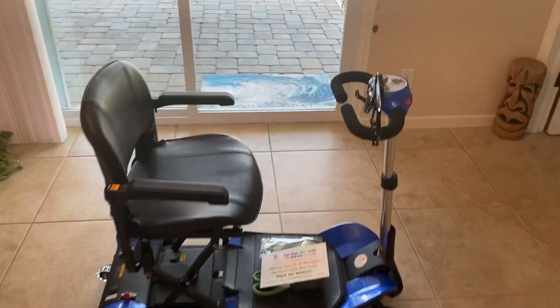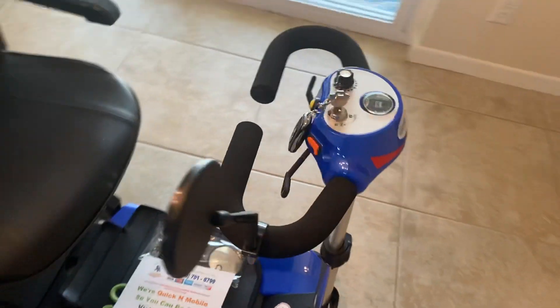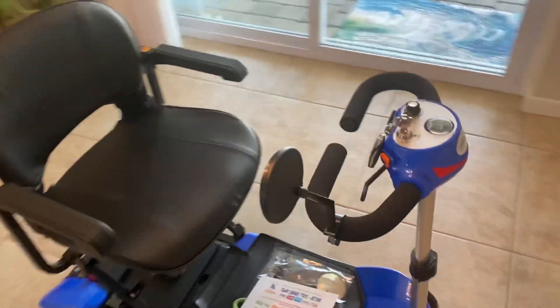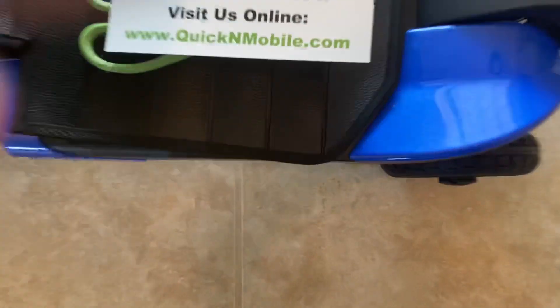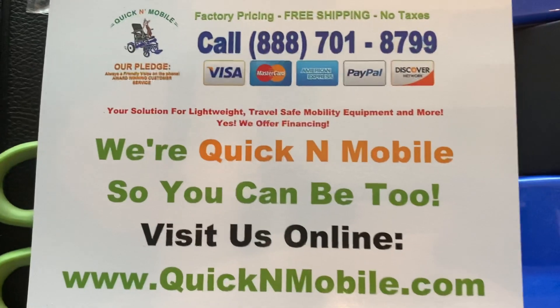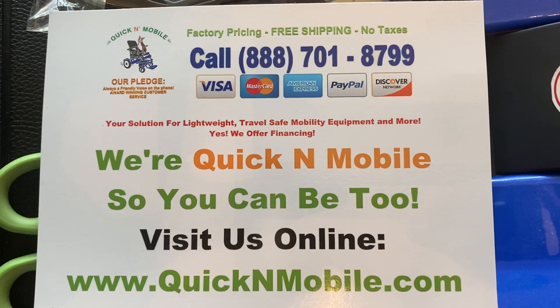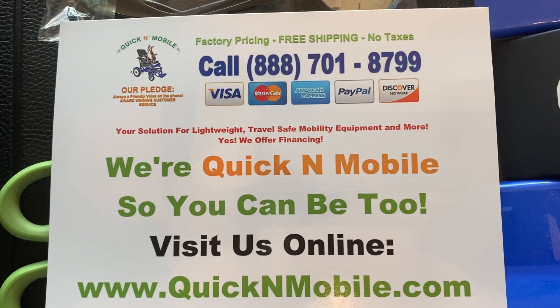Hello, this is Paul from quickenmobile.com. Right now you can see that we have an automatically folding Optimus mobility scooter with a mirror. Part of the free accessory package is mirrors on the scooter, so we're going to show you how to put the mirrors on. Before we get into this brief video, you might want to give this a pause so you can visit us online.